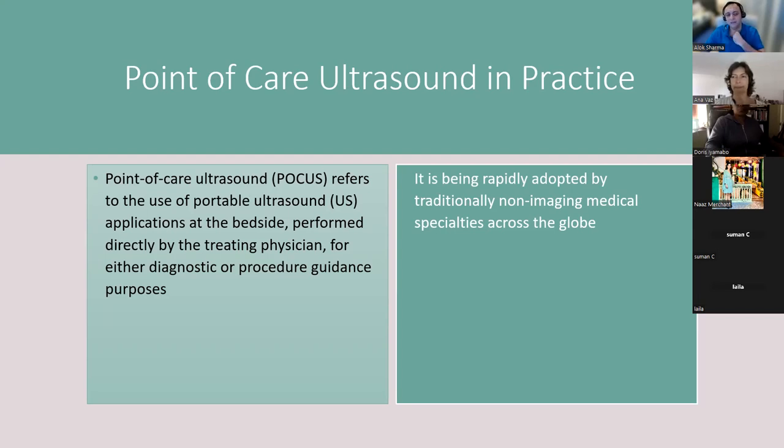And I think a lot of us have been using point of care ultrasound subsequent to doing x-rays. At least in the UK, the practice would still be that you get an x-ray, you get your lines. But if your lines are in good position, either in the umbilical vessels or even for PICC lines, it is an absolutely beautiful technique to look at the tip, but also to be able to adjust lines, but it does need a significant degree of practice.